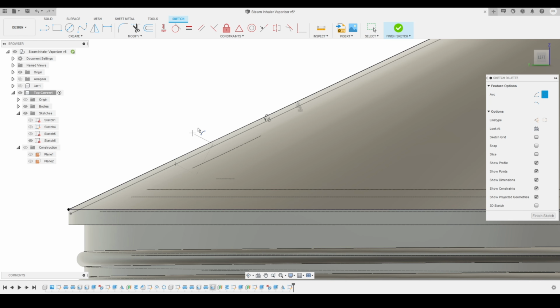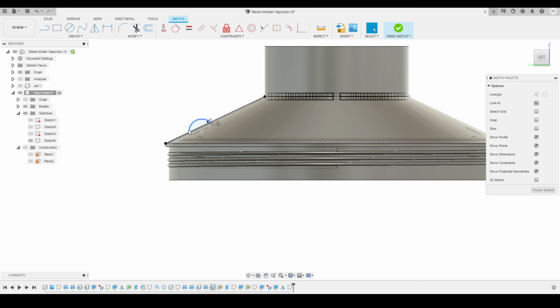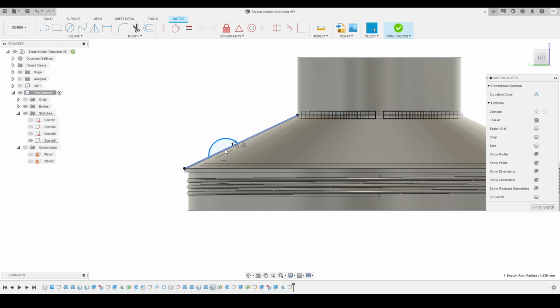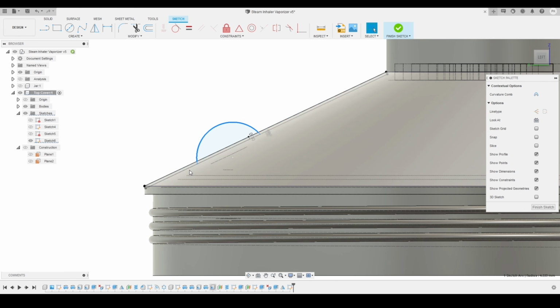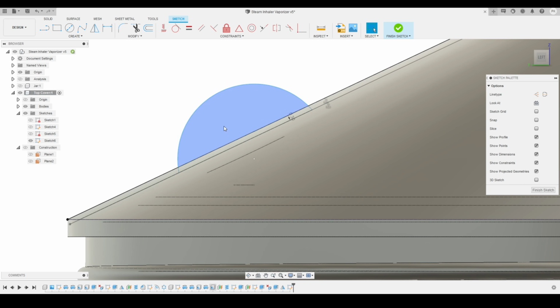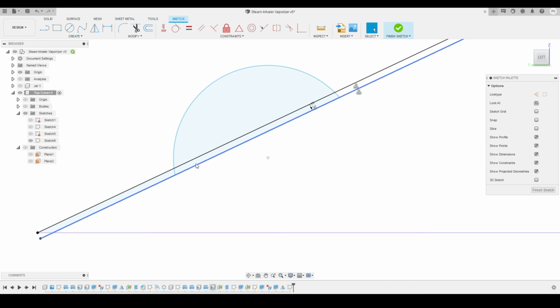We'll select one point over here and then one point somewhere over here like this, and I'm just creating a kind of clip over here that will help me to rotate the top cover by using my fingers, because these parts are all smooth. So just to hold and rotate the top cover, we are getting a piece like this.